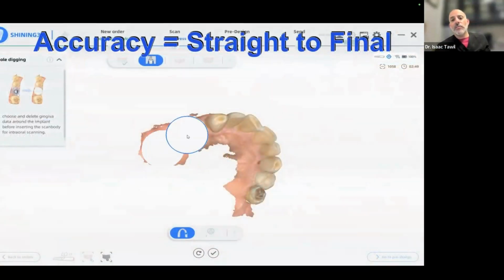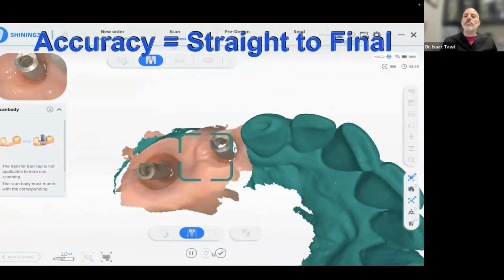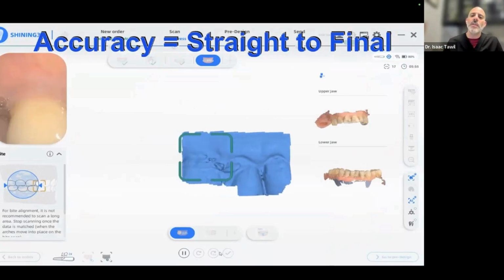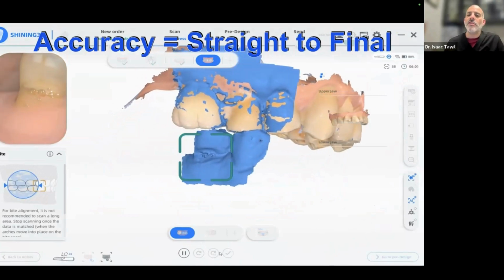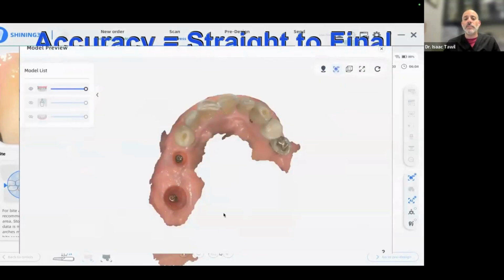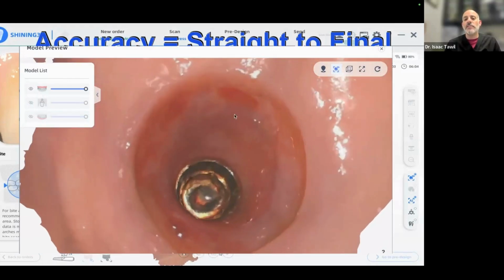What really shows me if I can do some good work, or have good accuracy, is if I take a case that is a timed case, meaning I'm going to engage the timing of the implant, the hexagon, the trilobe, the octagon. When I take my records, if I get a really good scan, if I can go straight to a final for a 3-unit screw-retained bridge, engaging abutments, then I know that I'm getting some really good accuracy. And as you can see here, you can zoom in again. Just look at the fine detail that this is giving you. You can almost see the screw hexagon inside the implant.